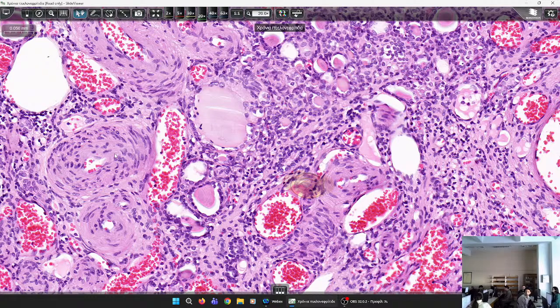So what is abnormal now? They are greatly thickened. How can this be justified? Why are these small vessels of the kidney thickened so much? It's not a matter of hypertension, as we had discussed. It's not a matter of nephrosclerosis due to hypertension or diabetes mellitus. Something else caused the thickening in these arteriole walls. What is that in this context? It is not hypertension. It is not diabetes mellitus.